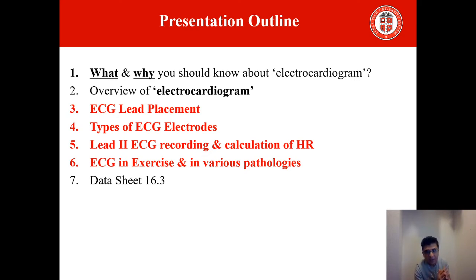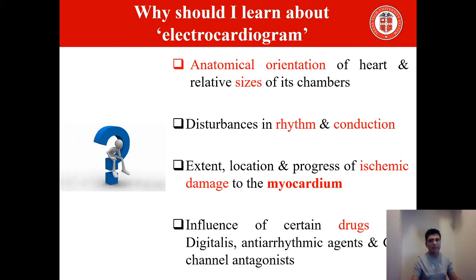And at the end, we will see how ECG changes with various pathologies as well as during exercise. And as we have been doing throughout our lab, the last thing is to go through the data sheet 16.3. So let's make a start.